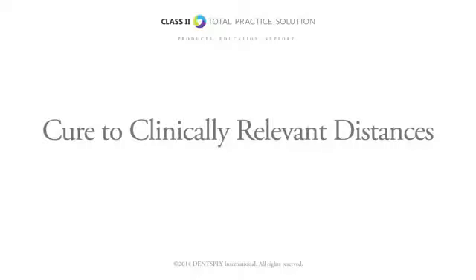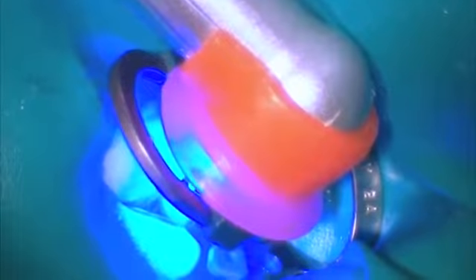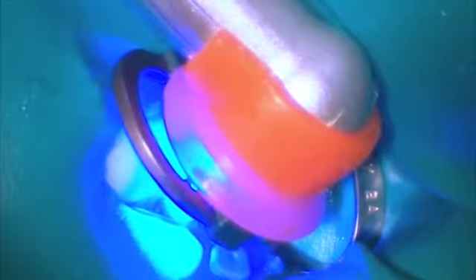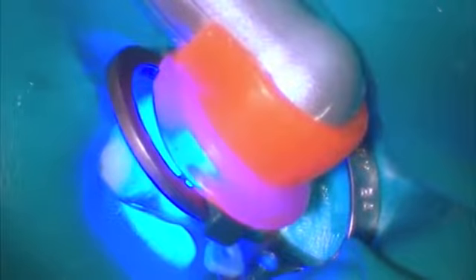The amount of light energy delivered by the curing light to the deepest layers of adhesive and composite is a critical factor in the success of a Class II restoration. A curing light with a collimated beam provides more confidence that enough light energy is reaching the bottom of the proximal box.